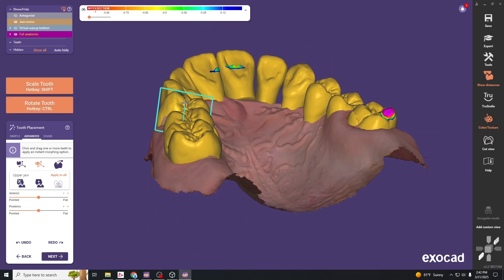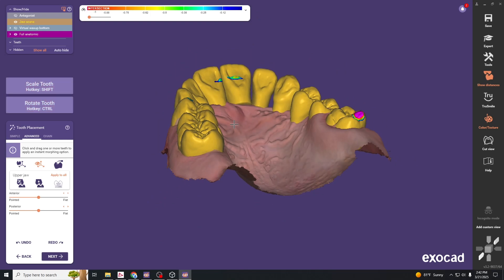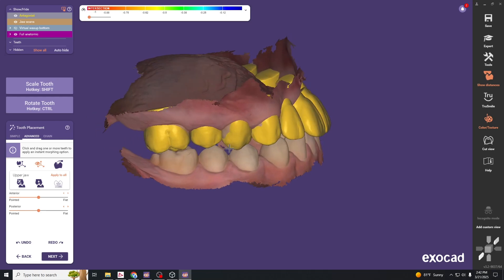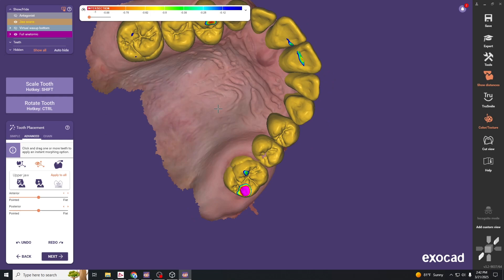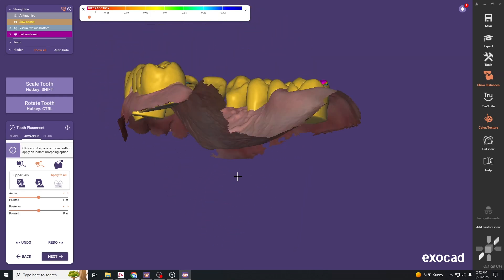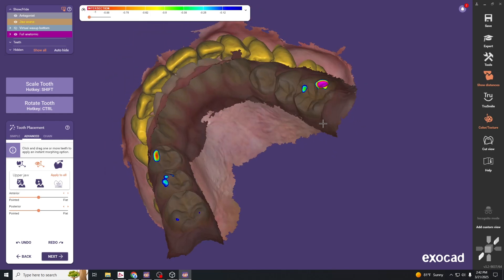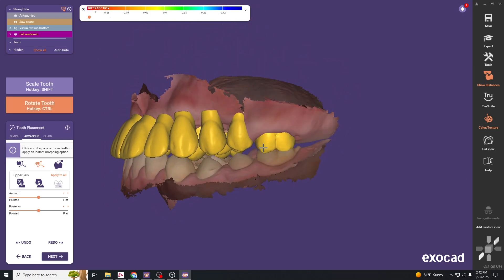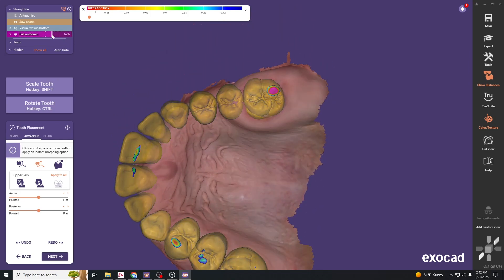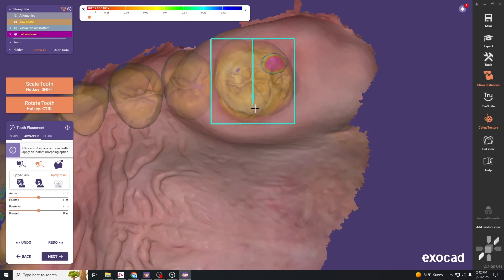The 'A' key is a shortcut to turn on and off the opposing or antagonist view. We want to see that we have some contact so the patient has occlusion. One tooth is a little too heavy in contact, so we'll adjust for that. Another tooth is overlying just a stub, so we'll make sure it fits right over that tooth.